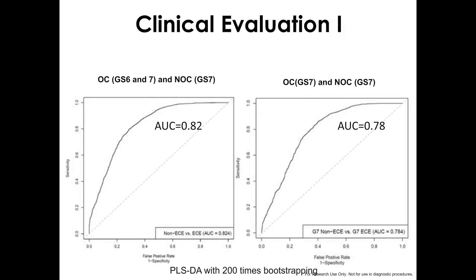When we did that for the first 31 of those candidate proteins, what this is showing is the MRM measurement of 31 of those candidate proteins in a different patient sample set. We can measure the area under the curve for their ability to discriminate organ-confined from non-organ confined disease, and that produced an AUC of around 0.8.